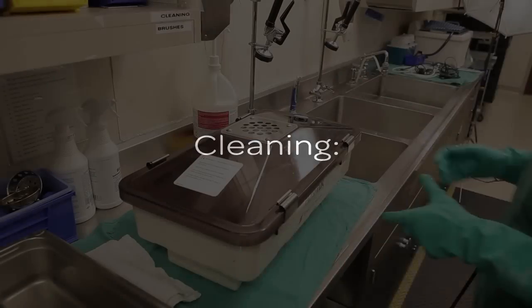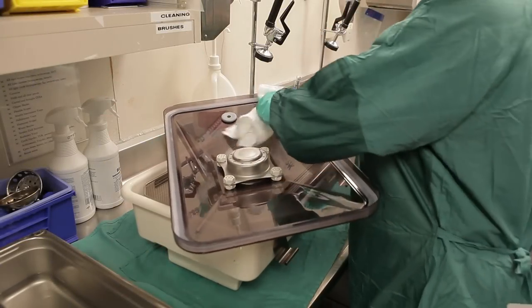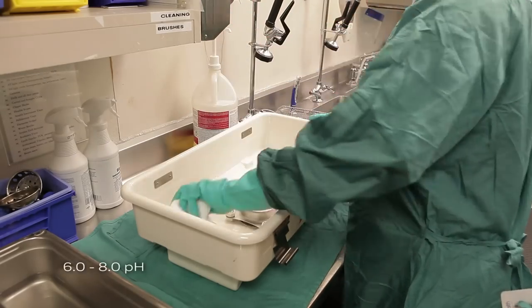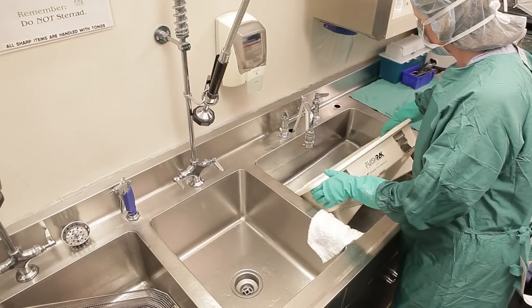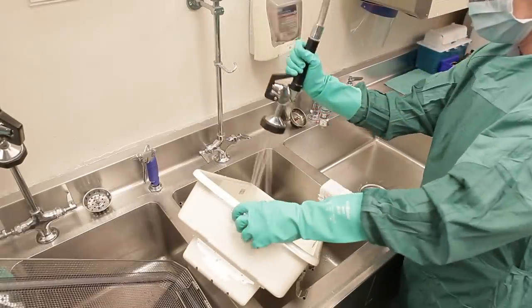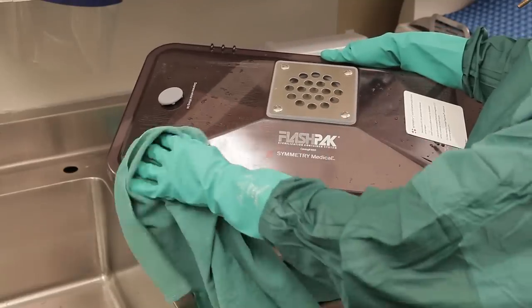When your FlashPak is ready for cleaning, manually wash all surfaces using a neutral 6.0 to 8.0 pH detergent solution and soft sponges or cloth wipes. The FlashPak may be fully immersed for easy cleaning. Rinse thoroughly with warm water and dry using lint-free absorbent towels or clean pressurized air.